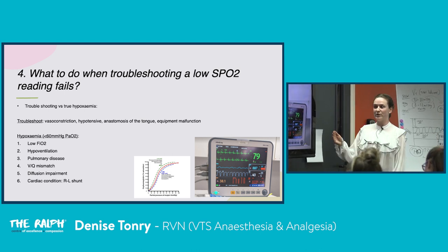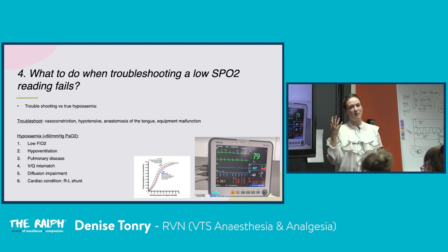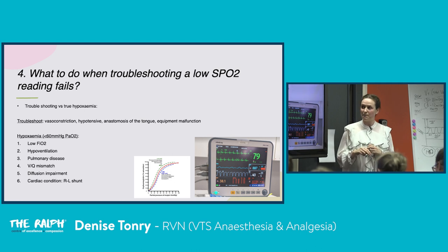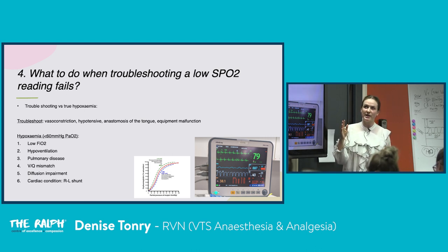So what are we going to do first? We're going to troubleshoot. I may have in the back of my mind that I have a patient that came in dyspneic, may have a pleural effusion, a pneumothorax. I may be keeping in my mind that if an SpO2 is dropping, it could be very much real. But it takes 5-10 seconds to run through a quick troubleshoot. And you're using probably the rest of your monitoring and an idea of what's been done to the patient: has something dramatically changed to cause this drop in SpO2?